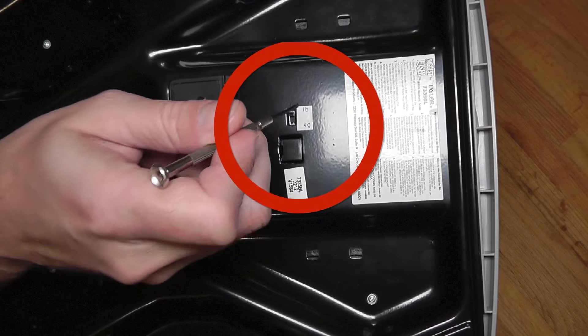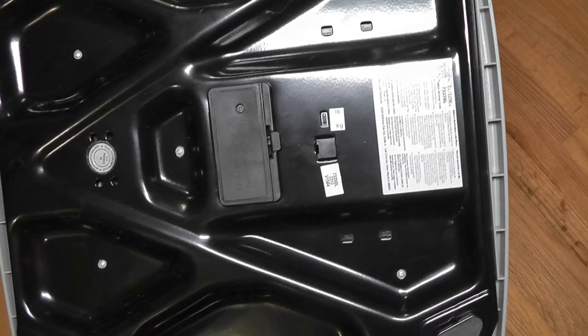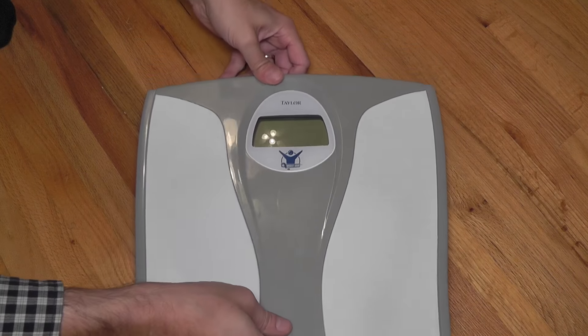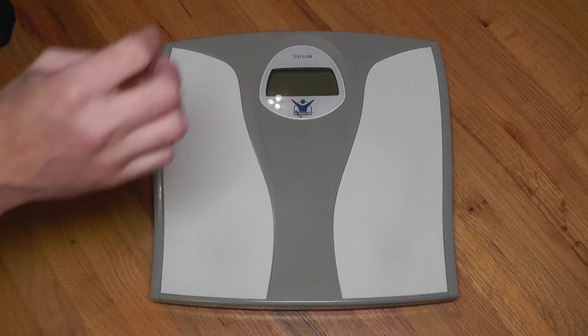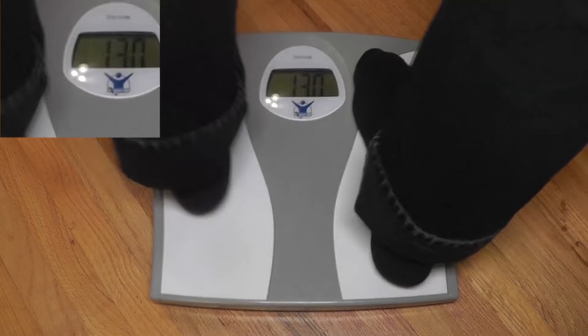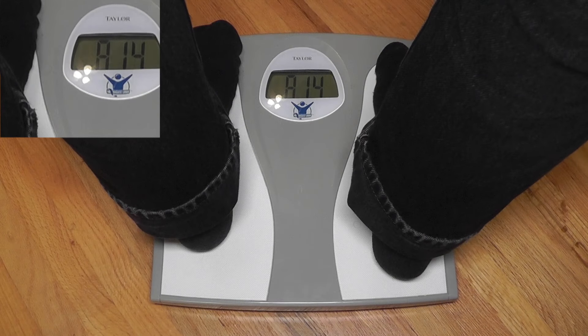You just turn the scale around and have a close look at what you see underneath. Some scales have a little switch on the bottom, and you just take a small item — for example a small screwdriver — and move the switch to whatever setting you want. In this case I'm going to switch it to kilograms, then put it right side up and check my weight.